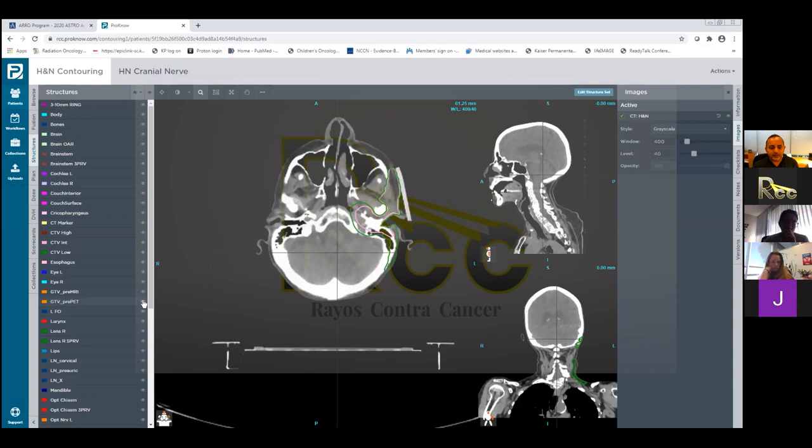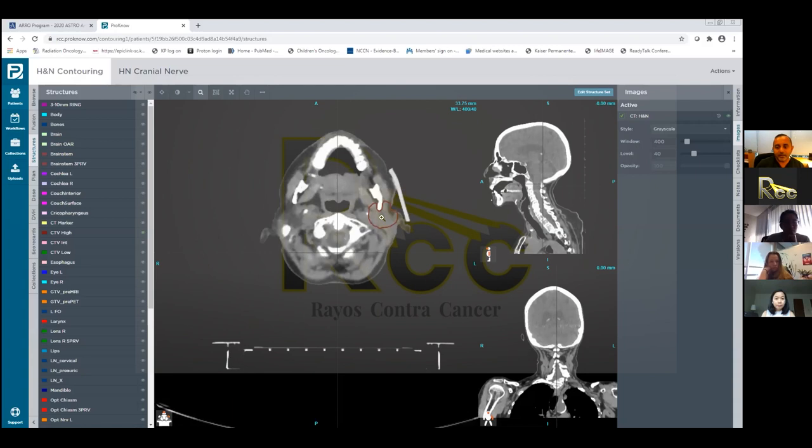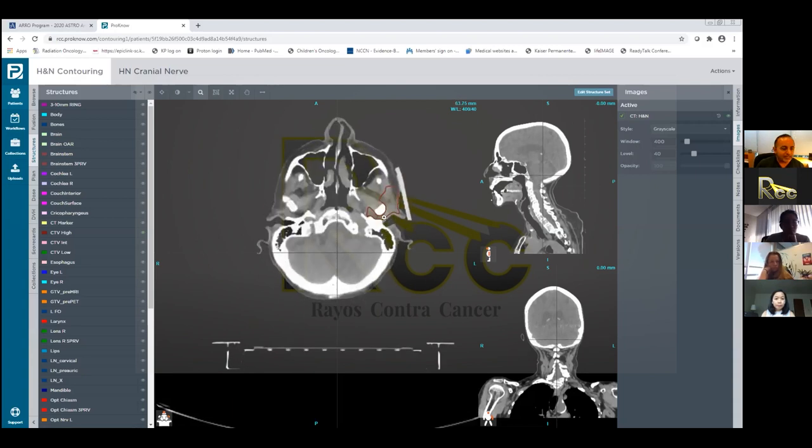We don't have the fusion here, but if you can imagine, this was her gross disease, where her disease was. She underwent a parotidectomy, and this is that high risk volume, right in the resection bed, where I'm giving 66. In the post-op setting, I'm conscientious of limiting the volume that goes to 66 gray because they've had extensive surgery, especially if I'm going to add chemotherapy. We can talk about that at the very end. So this is just the resection bed of that dominant mass, getting 66 gray. It's not even all of the parotid gland, but just where that mass was, with about a 7 millimeter anatomic margin.